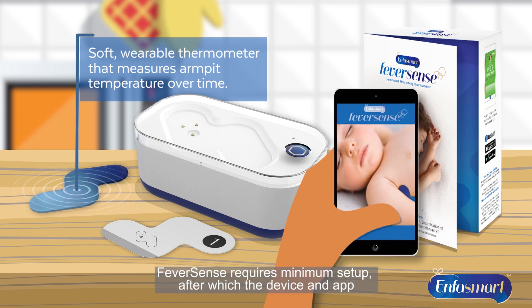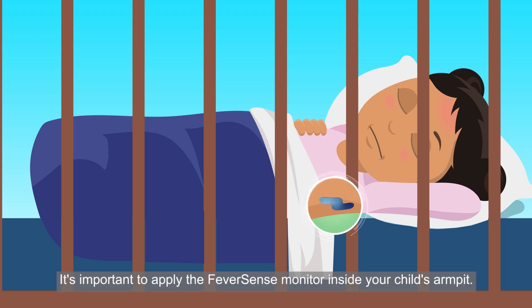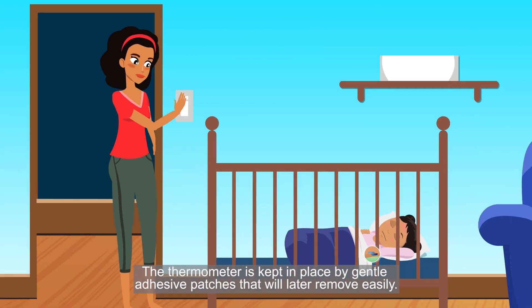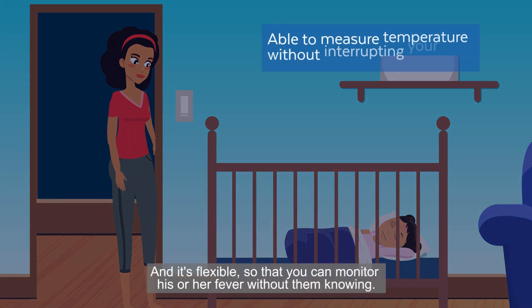FeverSense requires minimum setup, after which the device and app monitor the temperature readings for you. It's important to apply the FeverSense monitor inside your child's armpit. The thermometer is kept in place by gentle adhesive patches that will later remove easily, and it's flexible so that you can monitor his or her fever without them knowing.